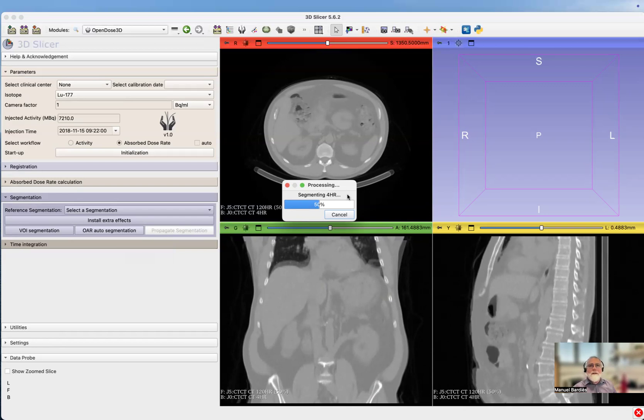Here we have a spleen, liver, three vertebrae L2, L3, L4, bone marrow dosimetry, and I think you have a spleen also.